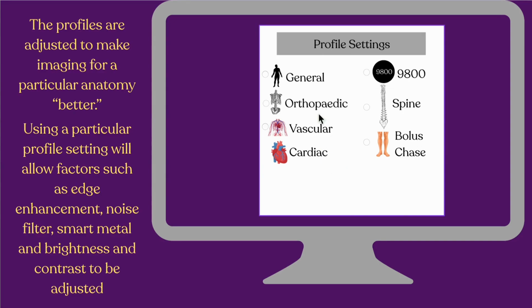Meaning if you are doing a ORIF of an ankle, usually you would want to choose the orthopedic setting, but you may be working with a surgeon that actually prefers the spine settings or the general settings instead of the orthopedic settings for that particular case.